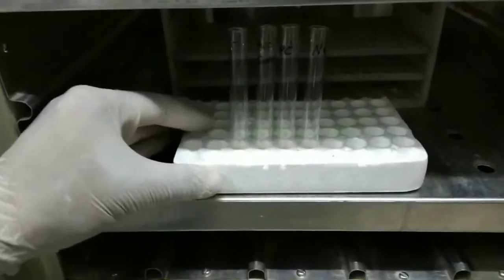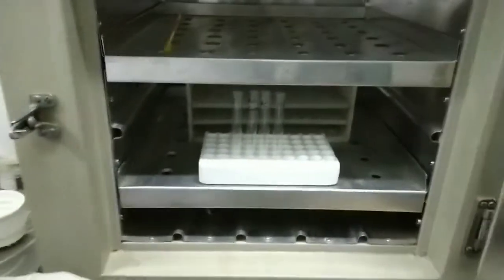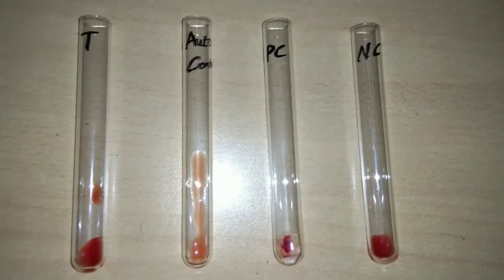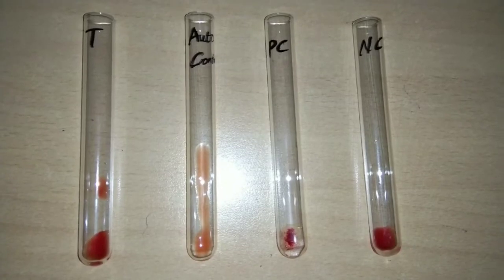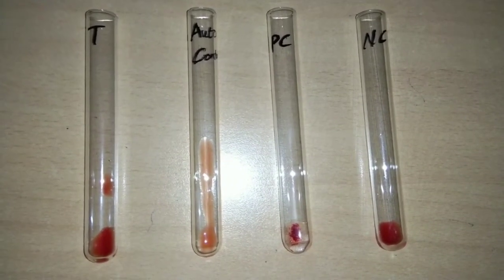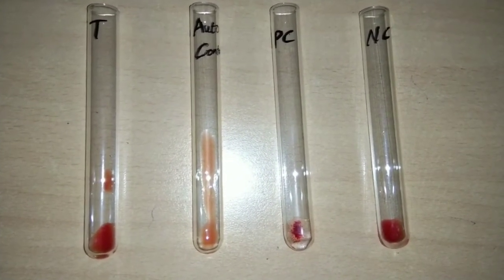Incubate the tubes at 37 degrees centigrade for one hour. After incubation, look for agglutination. There is no agglutination seen in the test tube, auto control, and negative control tube. Agglutination is seen in the positive control tube.